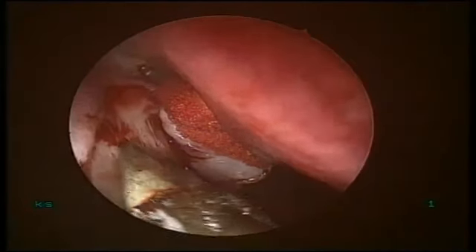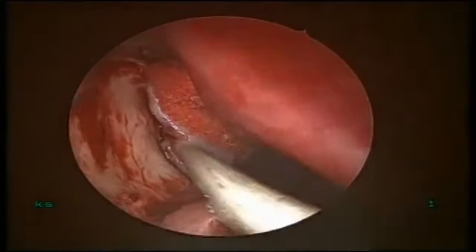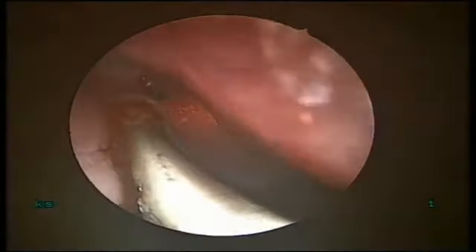No, nothing works. It's not a sinus disease for which all this is required. Touch.